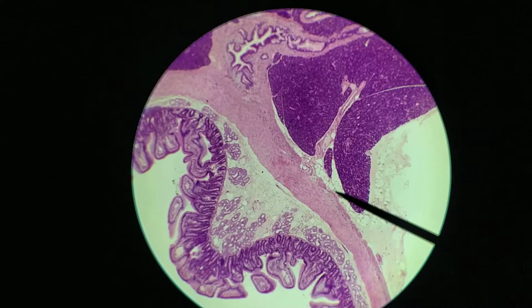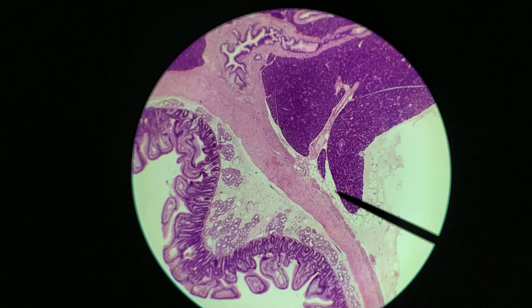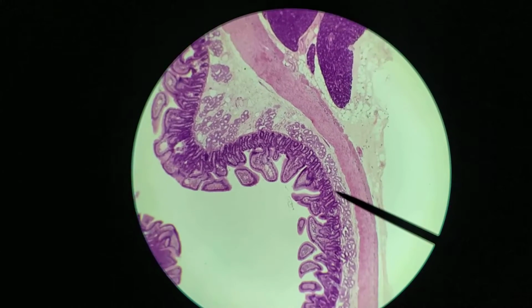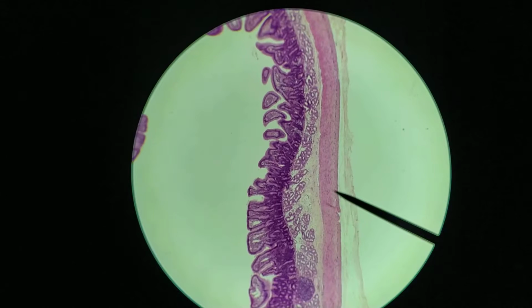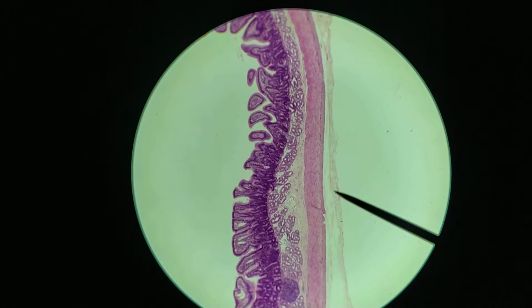So in this region here, the duodenum has a tunica adventitia, whereas further away we can see a free surface. And so further away what we have is the tunica serosa. Okay, so the duodenum, unlike the other parts of the small intestine, actually can have both an adventitia and a tunica serosa on the outside, whereas the other parts of the small intestine will only have a tunica serosa.